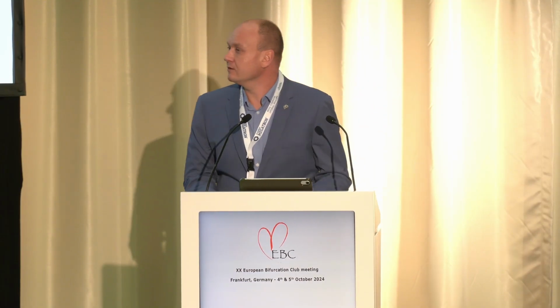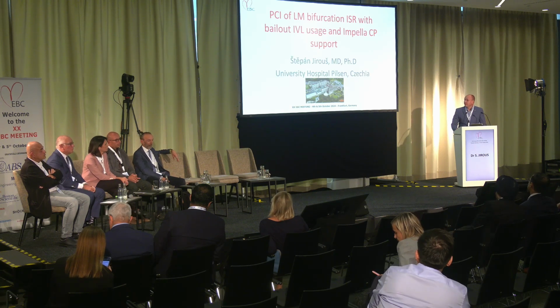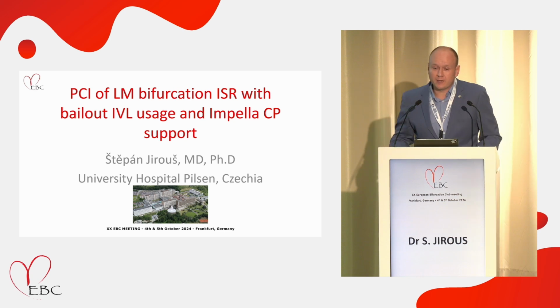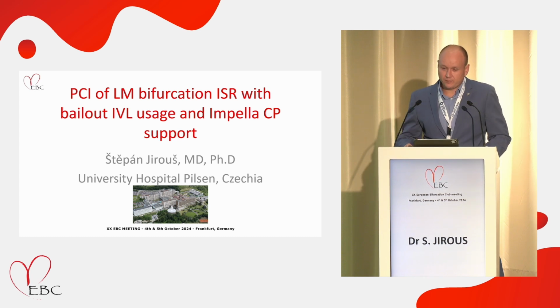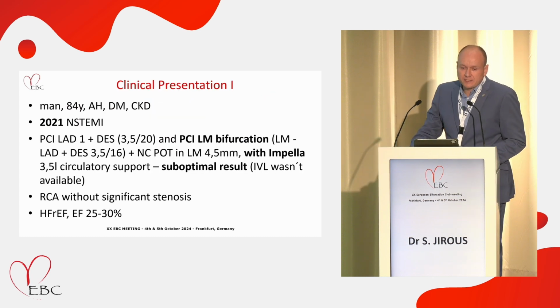Dear Chairman, thank you very much for the invitation to this event. The topic of my presentation will be a case with a long name, but it will be short, don't worry. PCI of left main bifurcation in-stent restenosis with bailout usage of IVL and Impella-CP support. My name is Stepan Jirous and I am from University Hospital in Pilsen in the Czech Republic. Let's start with the clinical presentation.